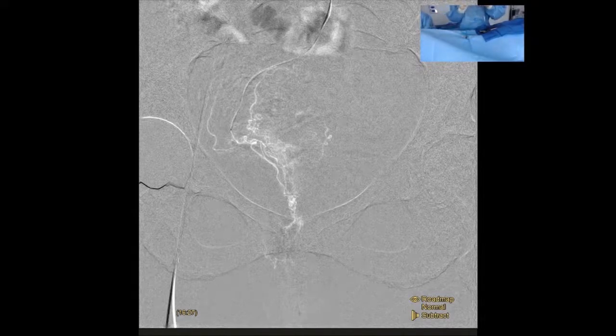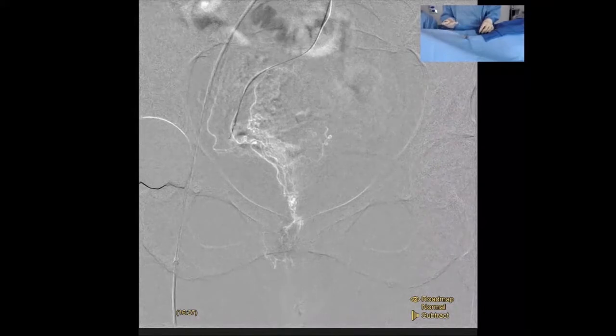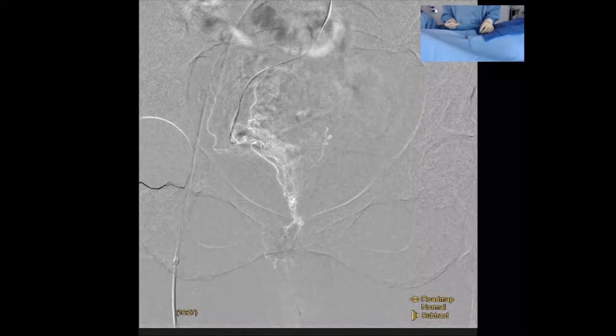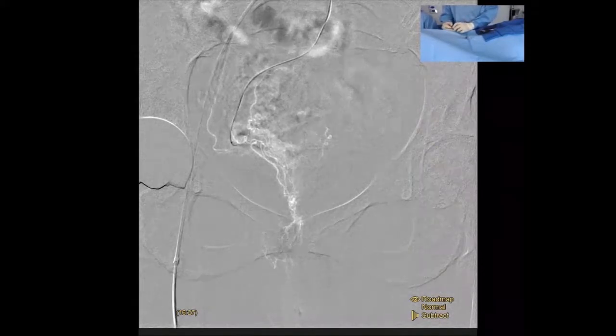So with that technique, I would say we are oftentimes able to get distal embolization there at that cushion, because that's what we're looking for, right? My fear of just using particles, of course, is the amount of particles you need to achieve stasis. And in the most recent randomized control study, a comparative study that looked at different size embolics, it looks like no matter what, it's still favoring going towards that mucosal vessel.